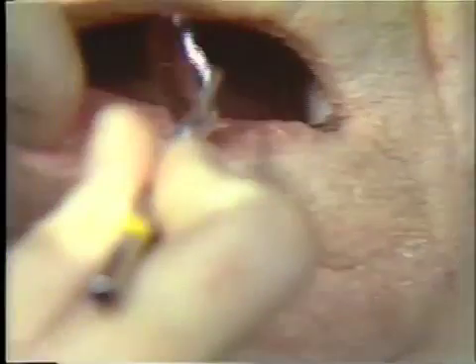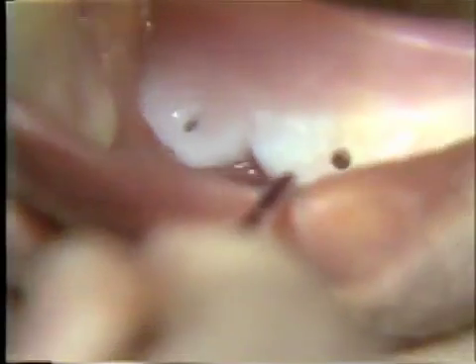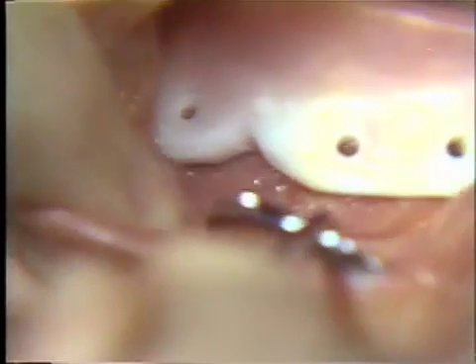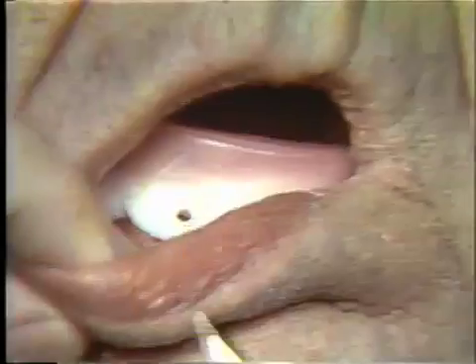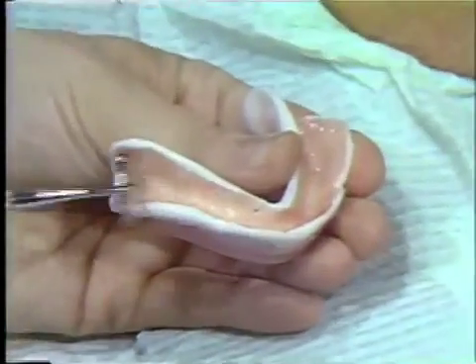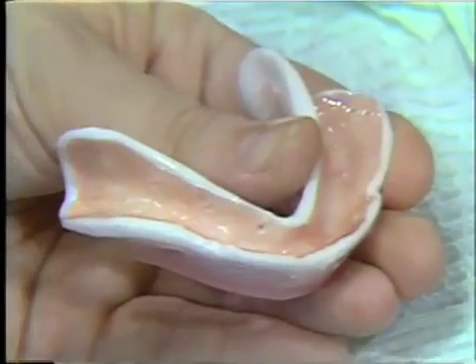Moving to the other side of the mouth, you will notice that the labial flange on this side is at the proper extension. In fact, the tissue comes through the buccal notch quite nicely. You notice it moves into that notch quite nicely, and indeed this flange is of the proper length, as it is here in the labial region.